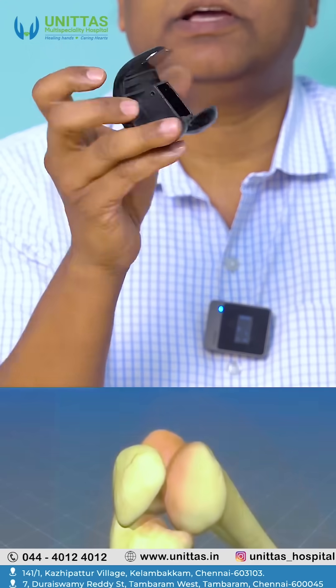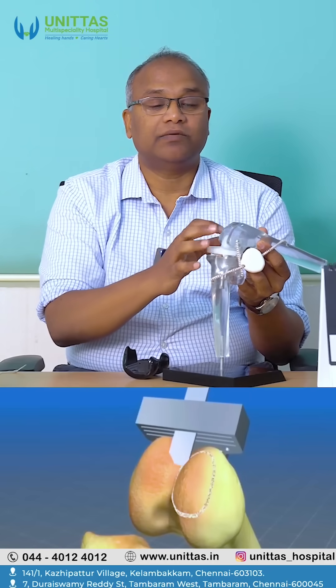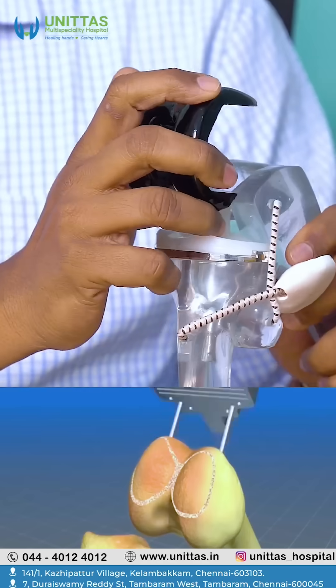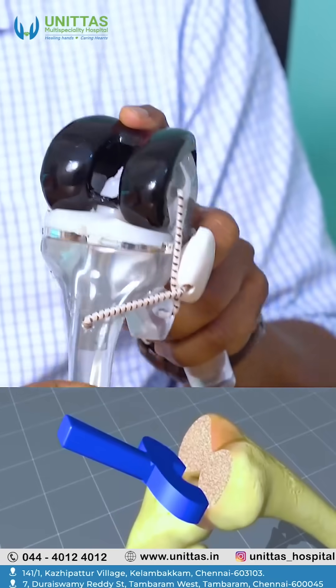We do a surgery to open the knee out. This will be the actual implant, how it looks in real life. While operations, we open the knee joint and then make cuts in the bones. This particular part will fit into the bone. This is how it looks in real life, but these are models.